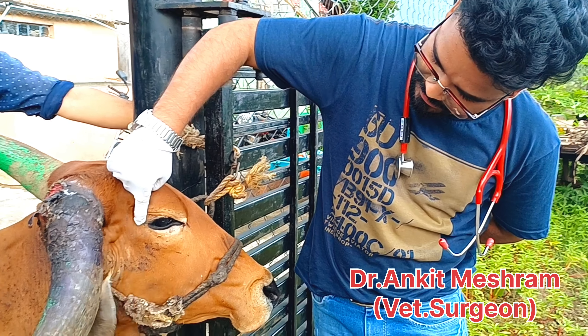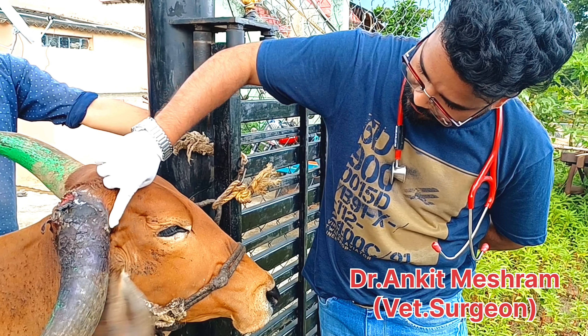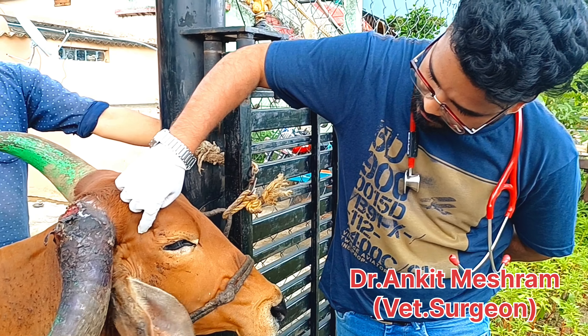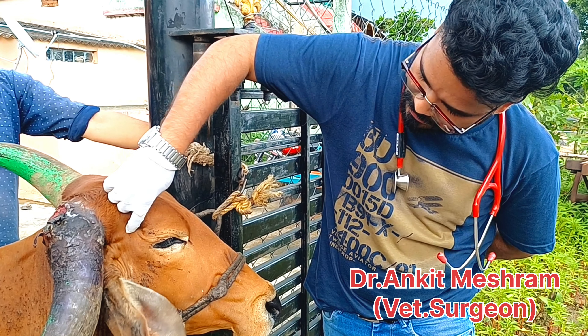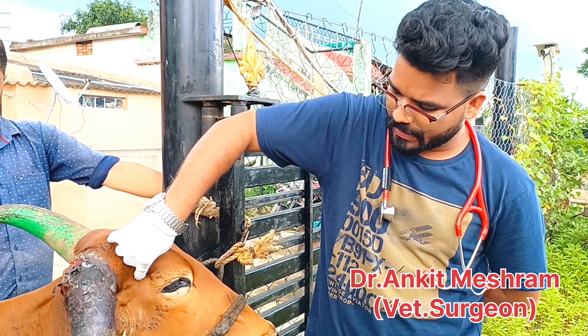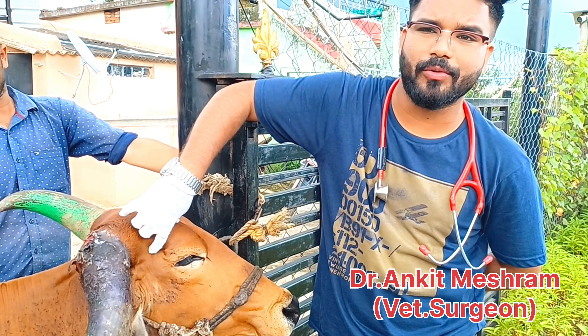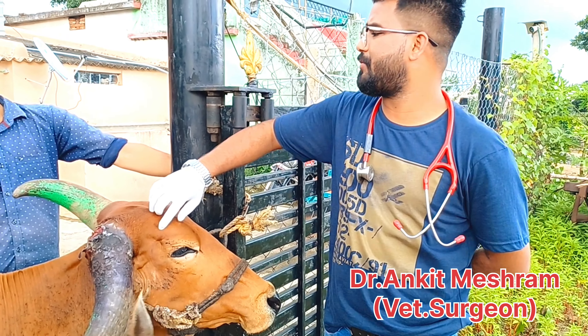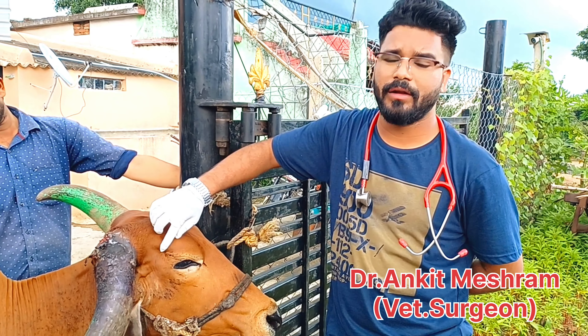This is the dry line between the lateral canthus of the eye and the base of the horn. Between this position, this is known as the cornual nerve. If you penetrate very deeply with the local anesthesia, this is not a cornual nerve block — it will go to another place and the cornual nerve block will not happen. You will not succeed.